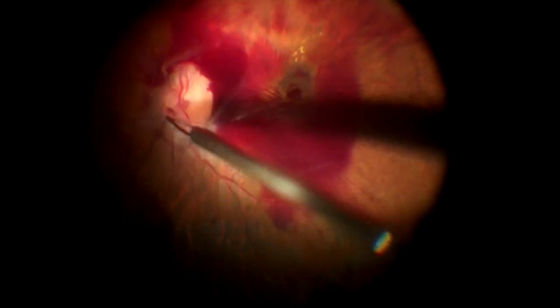We are just removing the hyaloid here, and once we remove the hyaloid right from the disc and move it on, you can remove the blood. We trim the hyaloid here and reach the retina to remove the pre-retinal blood.